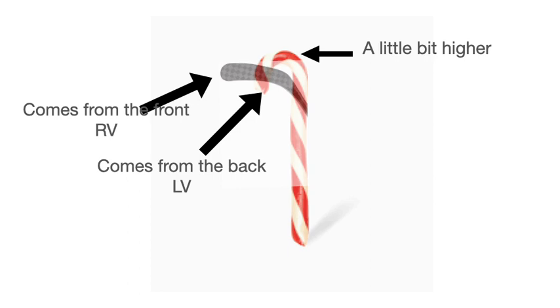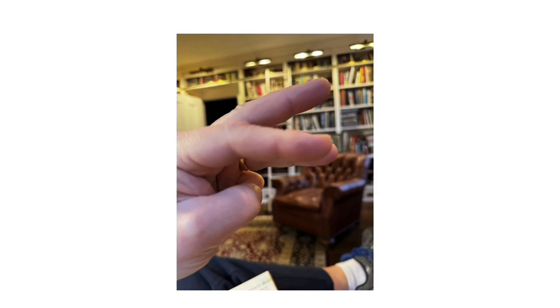And basically, that hockey stick really represents the right ventricle, the main pulmonary artery, the ductus arteriosus, and that it ends in the descending aorta. Here's a picture of my hand while I'm putting this lecture together.